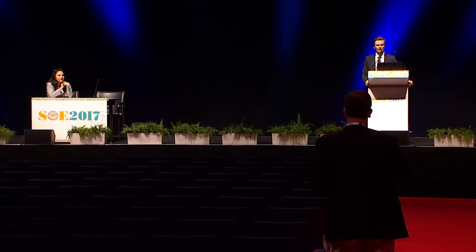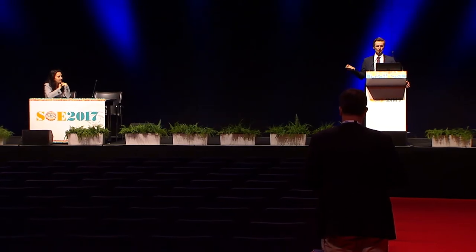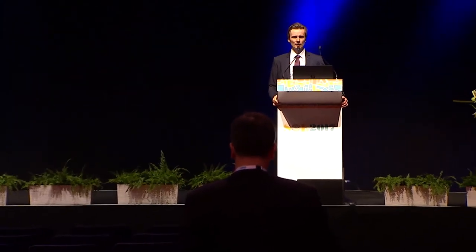Twin light. This is twin light. So there are two major types of chandelier. Mono, just one light, and practically you use half of the brightness. You can use very minimal brightness. Actually, during the surgery, I use a dark system, so you can use 50% of the light, 40% of the light.